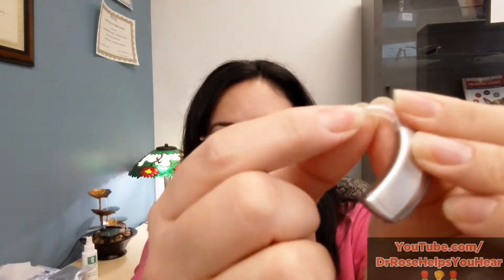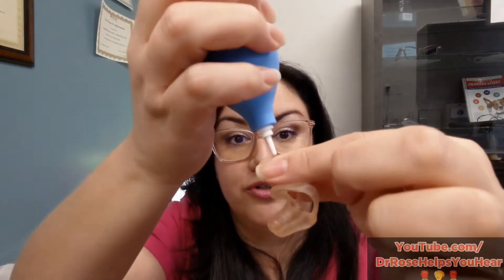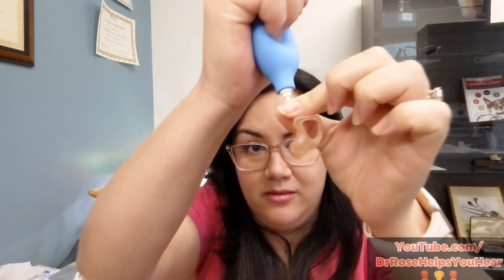If your hook has a filter, you can't use the tube blower method. Instead, put a small sharpie mark on the tube and on the hook before you remove the tubing. That way, after you separate the tube from the hook, you can line up the marks and put it back in the correct orientation. There are 360 degrees and 359 wrong ways to put it back on — being off even slightly can cause discomfort or ear pain. Then use the tube blower at the top of the detached tube, blowing toward the ear mold end, making sure you feel air coming out so you know all the debris is cleared.